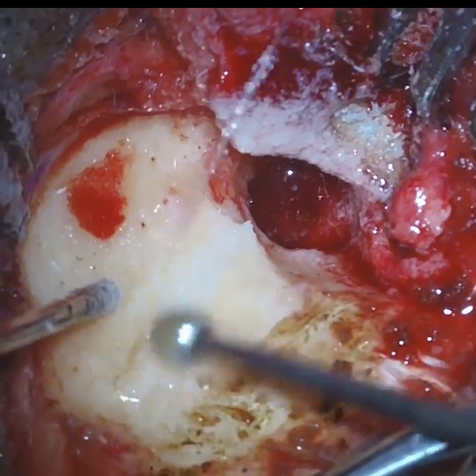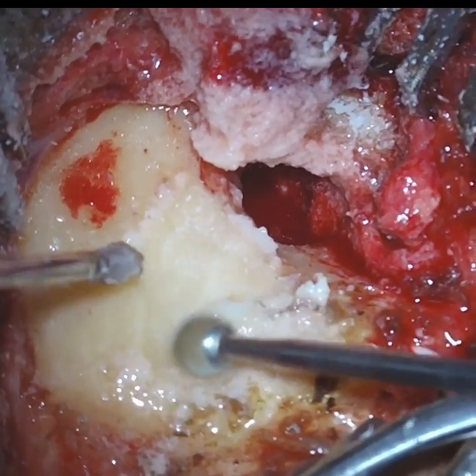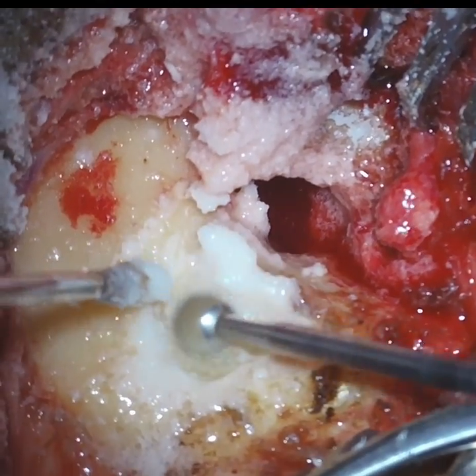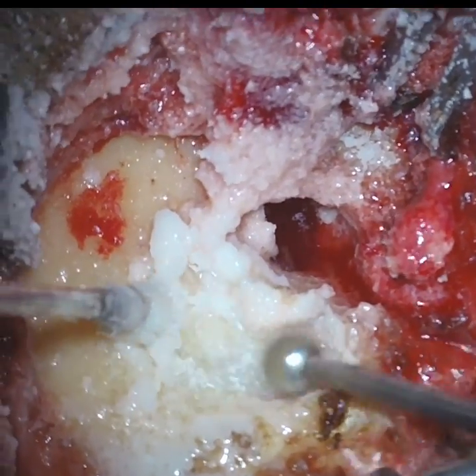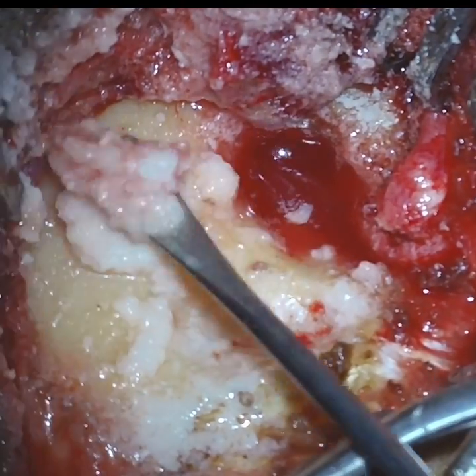Here, as you are seeing, we have first started drilling, and this patient, we know, is going to have a big cavity. So we are going to collect some bone dust. This is a very good way of obliterating the mastoid cavity. Practically, it's very nice. Theoretically, it may have some controversies, but practically this method is very good. So you collect a lot of bone dust before you start actual drilling.